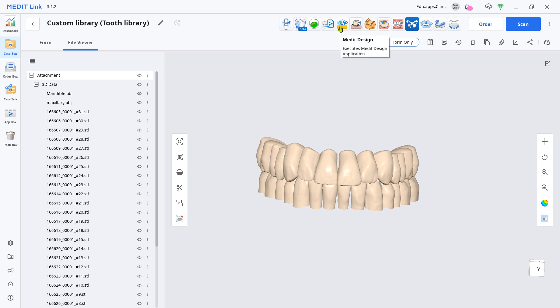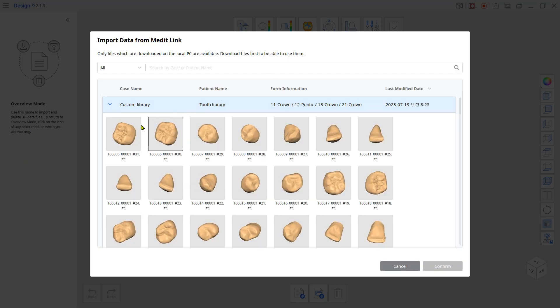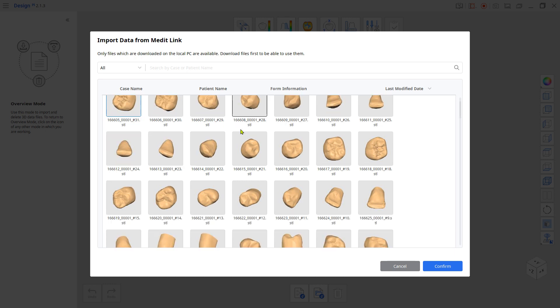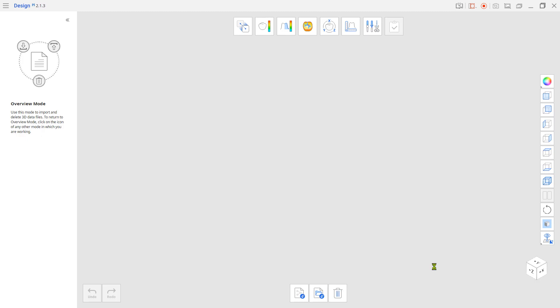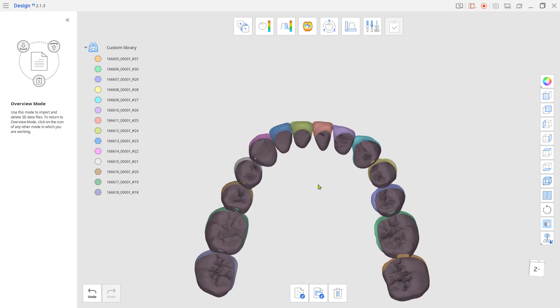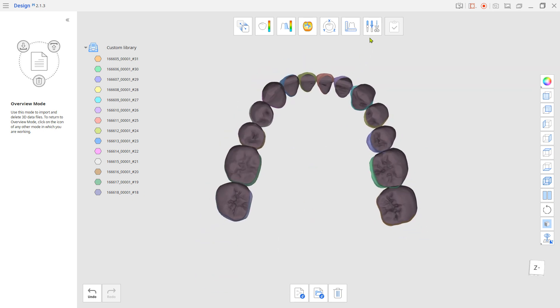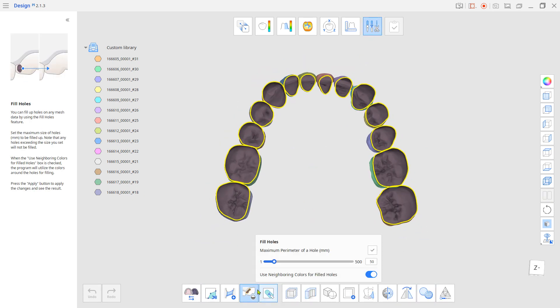Reload the design app and import only the mandible teeth this time. Close the bottom spaces and merge them with the Union tool.